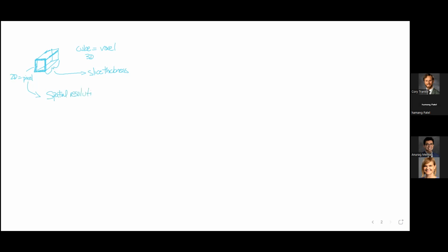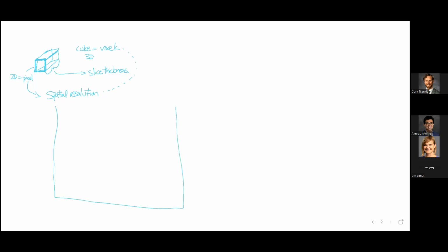You've got to be careful here, because your spatial resolution in what the scanner sees actually pertains to the whole voxel. But the important point here is we've got to make a picture, and remember, our whole thing has some depth to it, right?